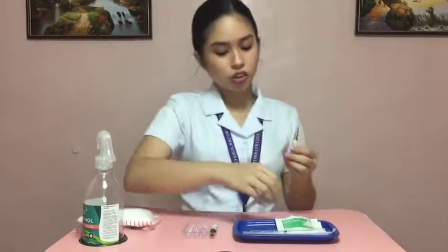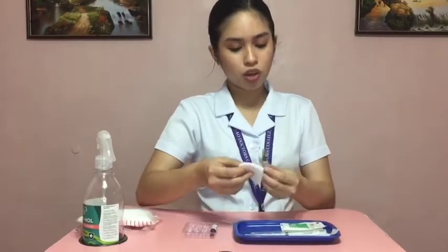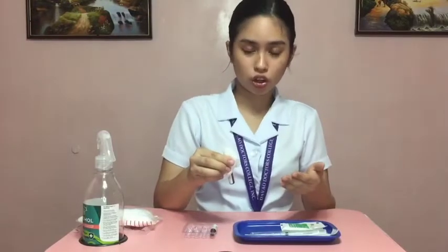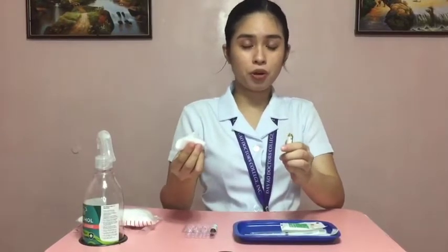Then dispose of the wipe. Now let's break the neck of the ampule by placing the sterile gauze and breaking it away from you and from the patient or the client. Now after breaking the top or the tip of the ampule, dispose of the tip in the sharps container.